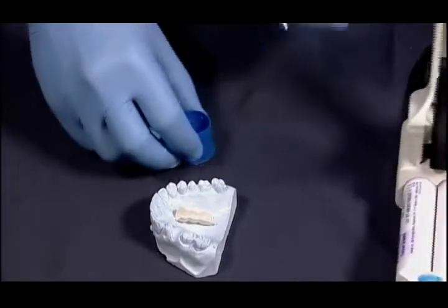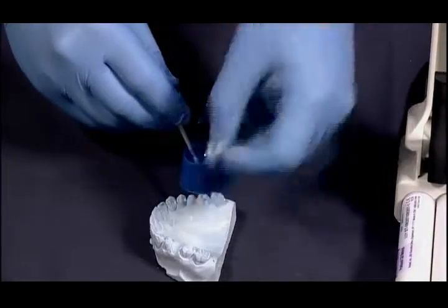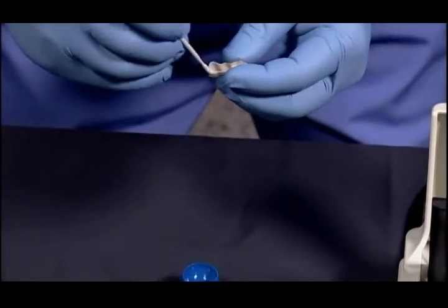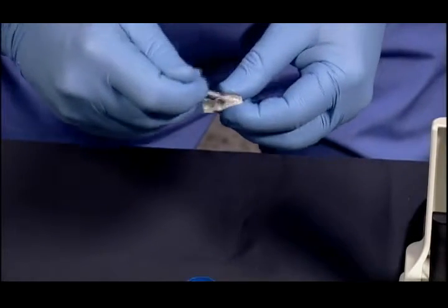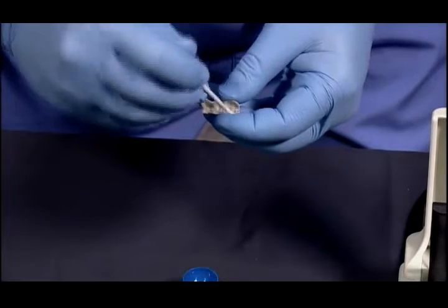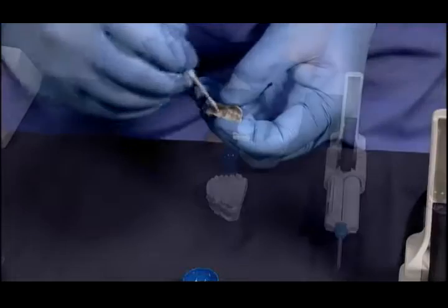I'll put a dot down inside there, and I will paint the internal aspects and any of the external aspects that we may feel that we need to, to get adhesion to the polycarbonate material. So I have painted the internal aspects with this Bis Acryl varnish.